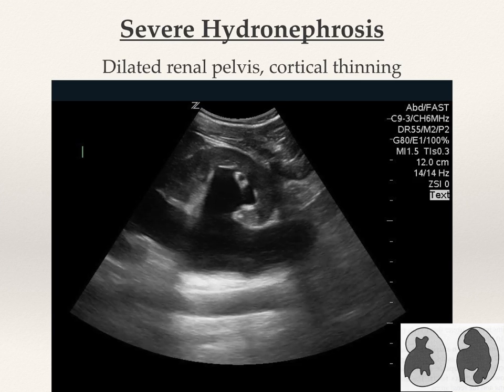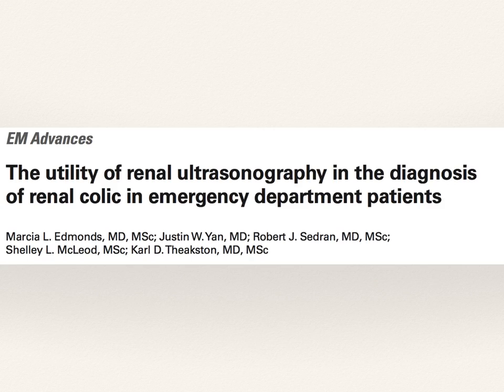Now, why we care about it is really from the point of view of looking at renal colic. That's going to be the one that we see most commonly. We'll still look at BPH and problems with catheters being blocked, but it's really renal colic. And there have been a number of studies that have looked at, well, can we use ultrasound more so to maybe forego the CT? We're getting better at having low-dose CTs, but if there is a way when we're working in rural settings or more remote settings, or maybe we just can't get that CT, to start guiding our management.